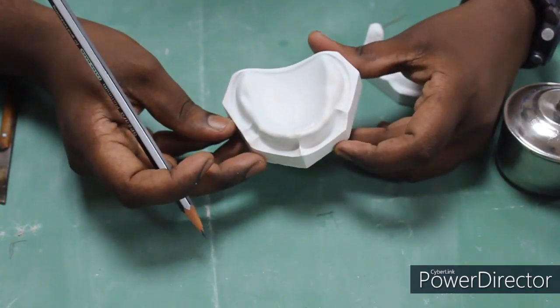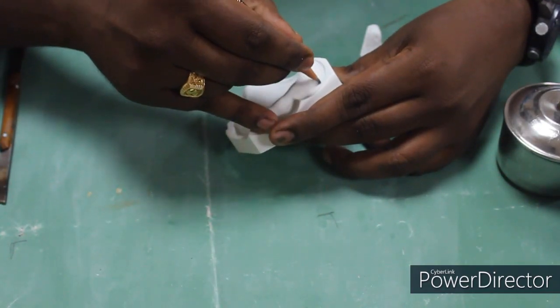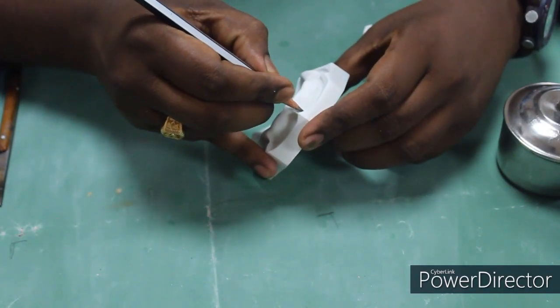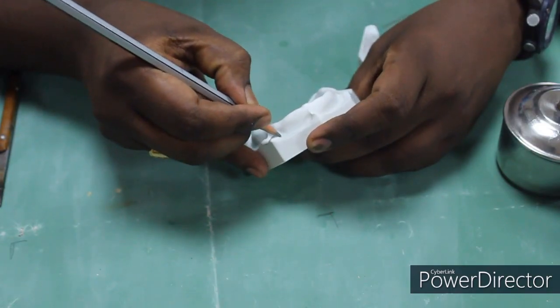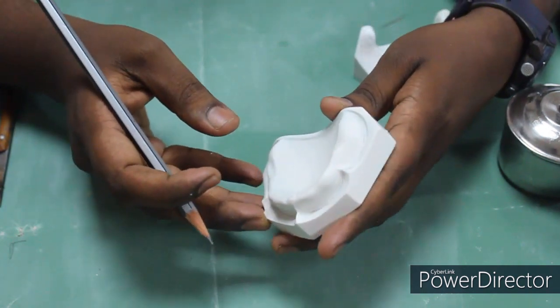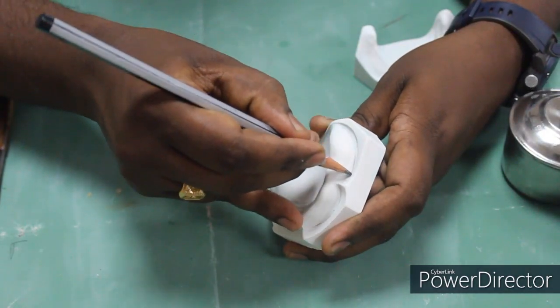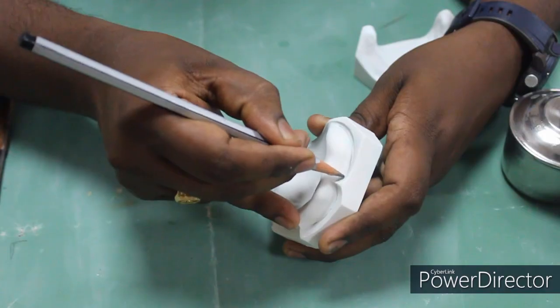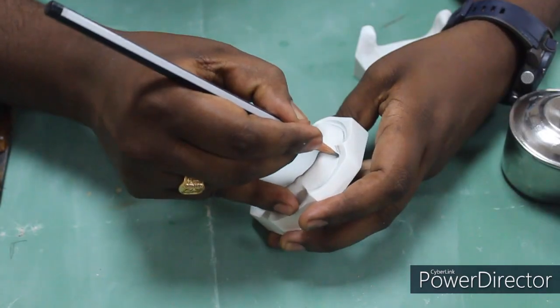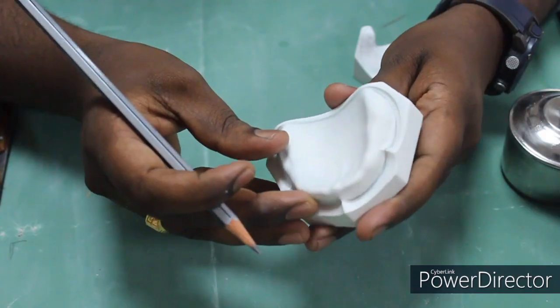So I am going to draw three lines. One is the depth of sulcus. This first line is the depth of sulcus. I think you are able to visualize it here. This is the first line, the depth of sulcus. I am highlighting this line. The first line is called the depth of sulcus.